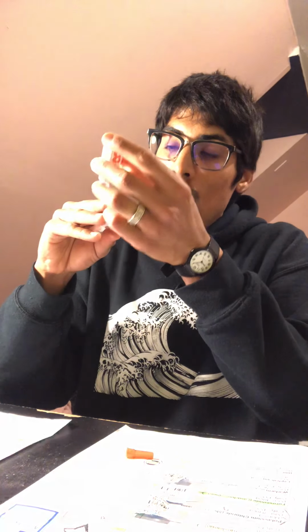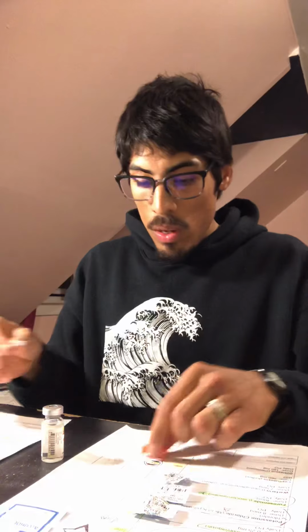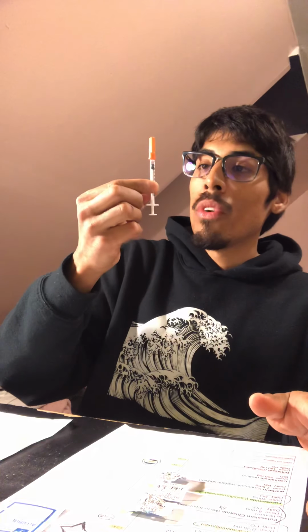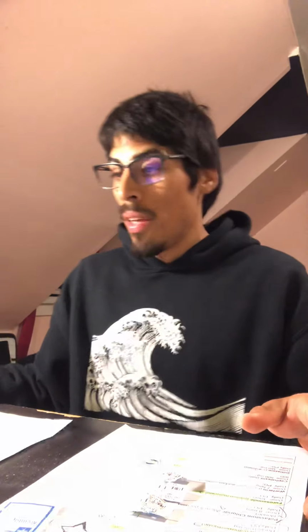So what you want to do at this point is, that looks good. Alright. Nice and easy. Hold on, take it out. Recap. Nice and slow. You want to get a second nurse to come in to check your medications. And so once she checks the medications, 2/28 regular insulin, 100 units per ml, she's going to check the needle. It's 4 units. It looks good. All right, great. Say thank you.